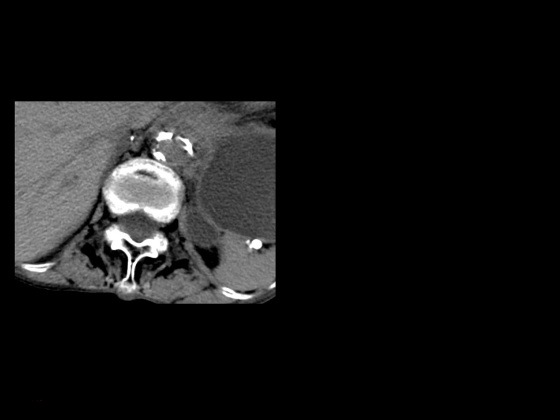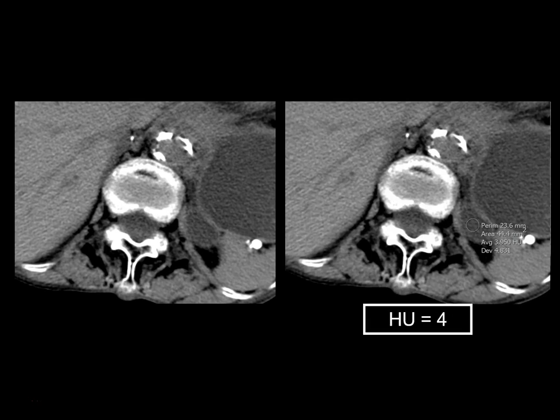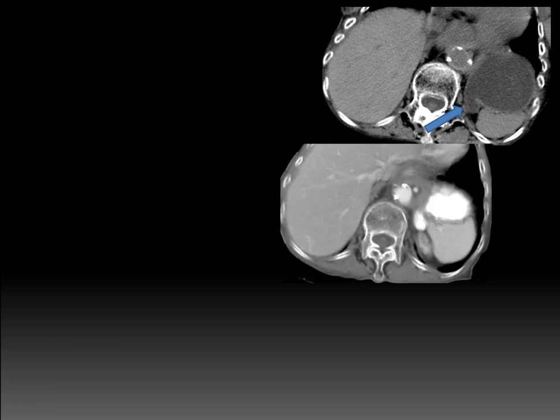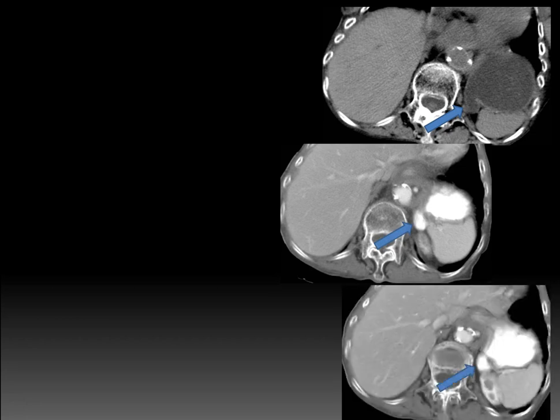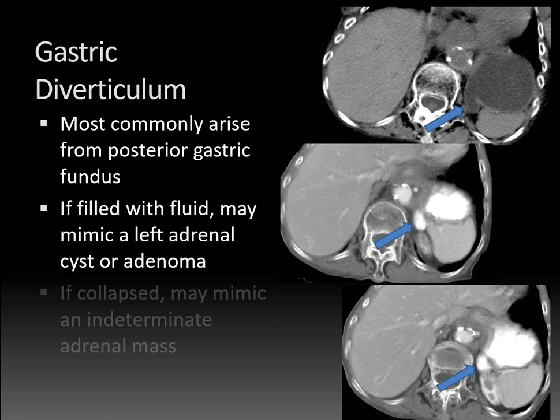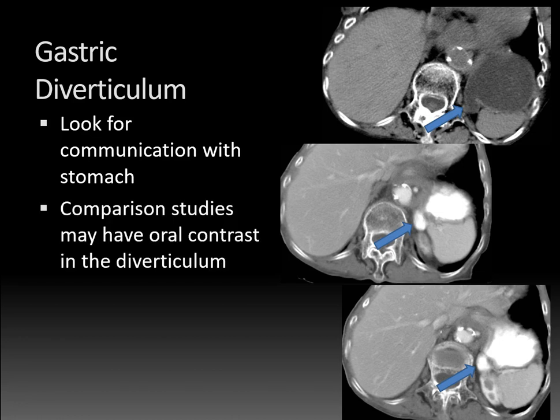Here's another case: a non-contrast CT scan showing an ovoid cystic lesion in the region of the left adrenal gland. Placing a region of interest gives a Hounsfield unit density of 4, consistent with fluid — probably a left adrenal cyst. However, if we look closely, it's actually communicating with the stomach. The patient had a prior study with oral contrast, and you can see oral contrast extending from the stomach into this structure posteriorly. This is typical for a gastric diverticulum. These most commonly arise from the posterior aspect of the gastric fundus. When fluid-filled, they can mimic a left adrenal cyst or even an adenoma. When collapsed, they can mimic an indeterminate adrenal mass. It's key to look for communication with the stomach — even if your current study lacks oral contrast, a prior study with oral contrast can be extremely helpful in confirming the diagnosis.